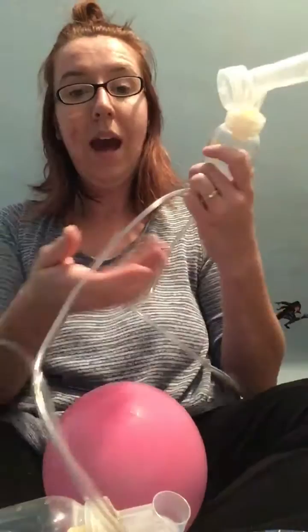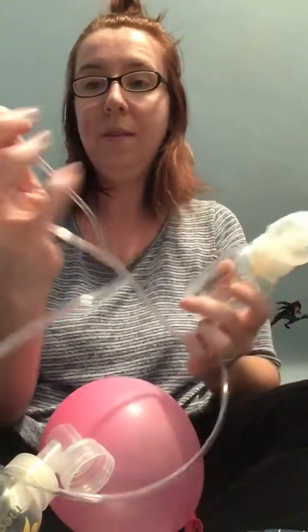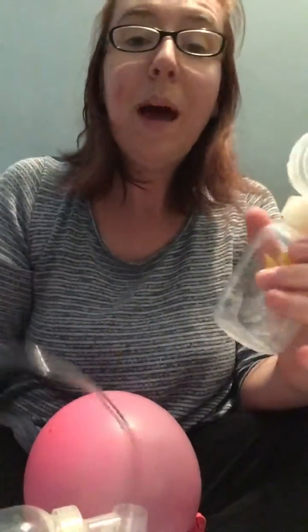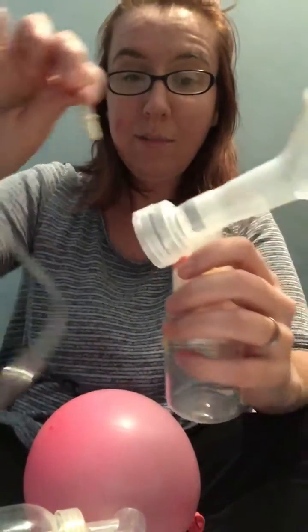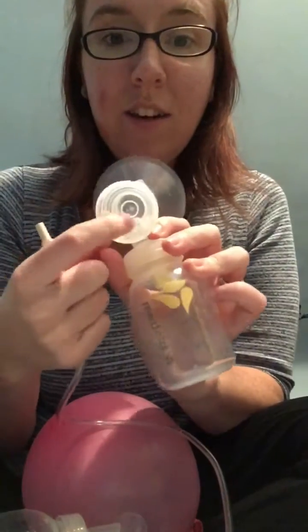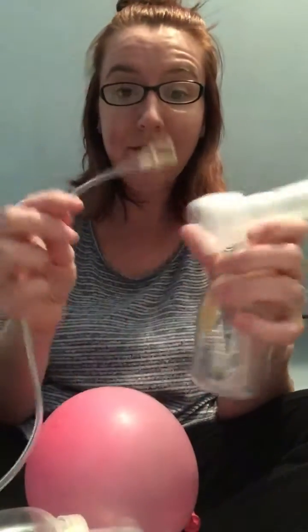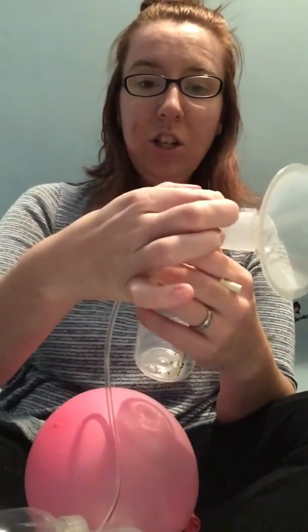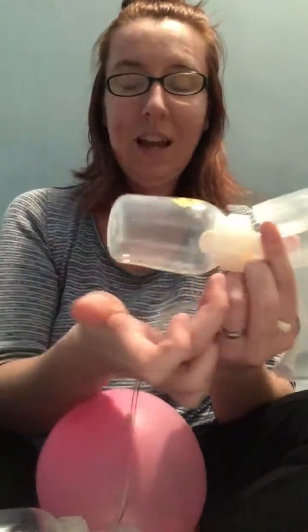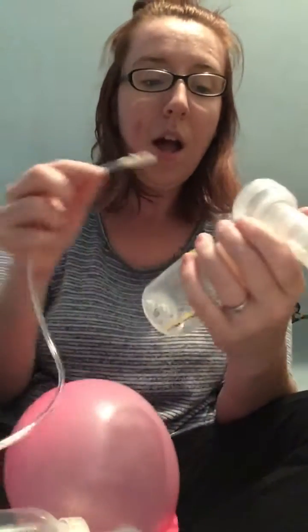And then of course you have your tubing. Now there's two different ends on the tubing. The ends are different. There is just a regular tube end, and then there is this plastic end. Depending on which type of pump you have, sometimes the tube fits into the top of the pump, and sometimes it actually fits in here in the back. Different pumps have different pieces, and I've even seen some of the new Medela pumps don't have this system at all. There's actually just a little circle at the top. It doesn't have the little yellow valve inside. There's just one piece that all fits right in the top.